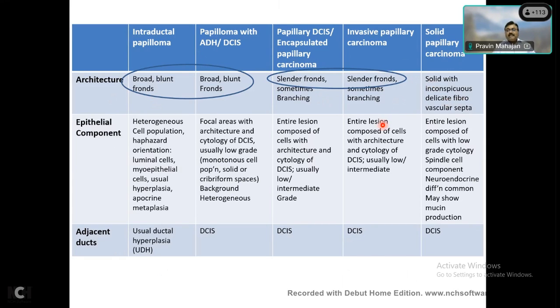In solid papillary carcinoma, you don't see proper broad or slender papillae, but the papillae we see are actually very delicate fibrovascular septa, which are kind of papillae there, which are inconspicuous.